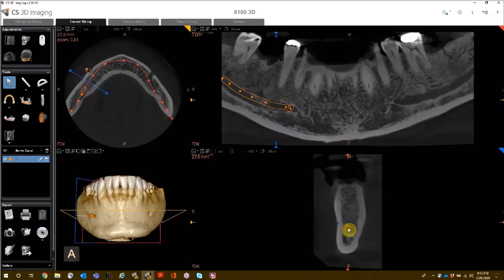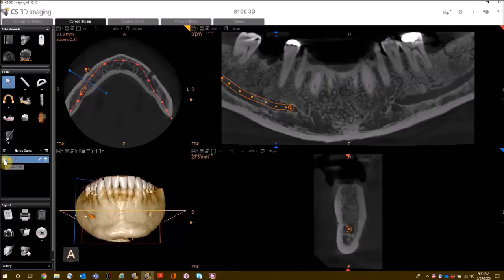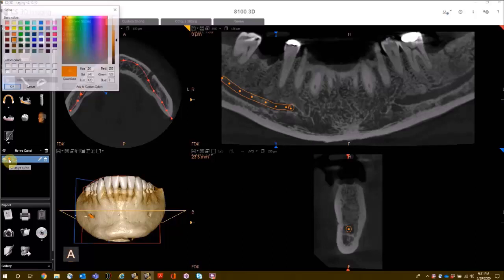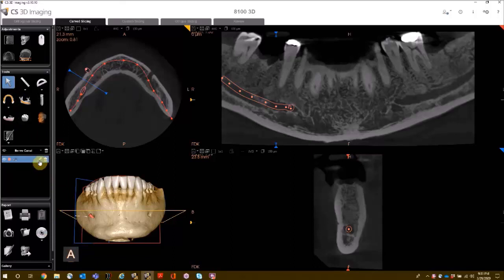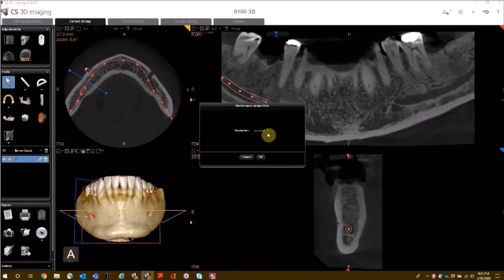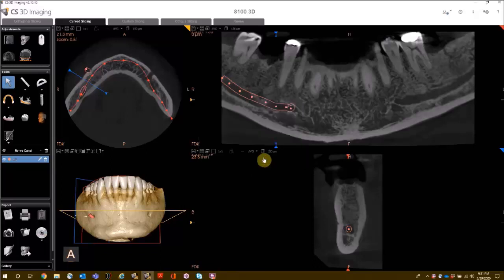If the control points are not correctly placed, you can grab the center circle and simply move it over. Your options for the nerve canal include show or hide the nerve canal, change the color, and change the diameter — the default is 2.5 millimeters. If you are not pleased with your nerve trace, you can delete it by clicking on the trash can.